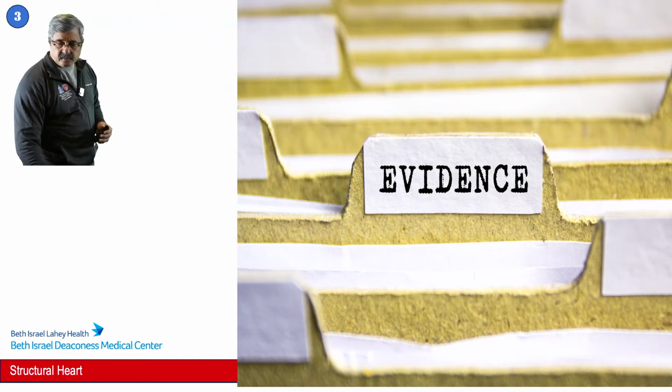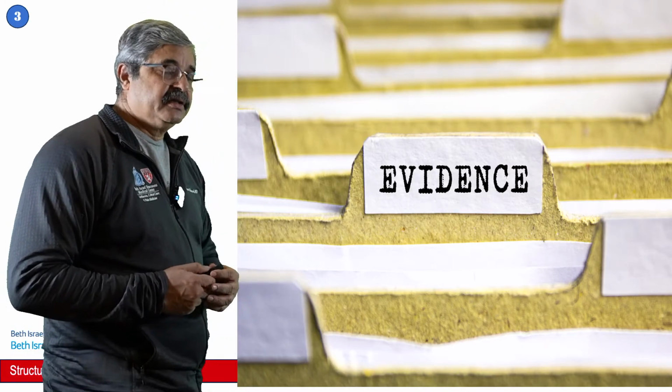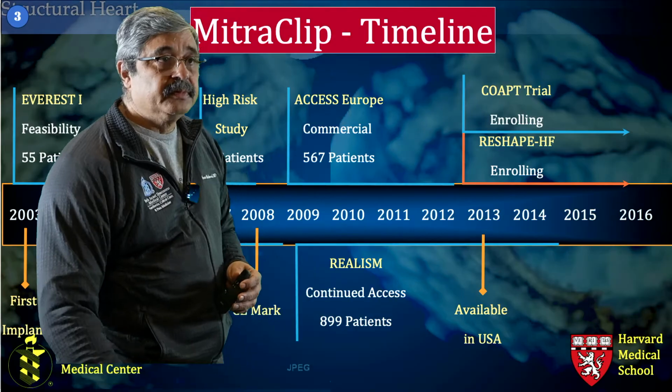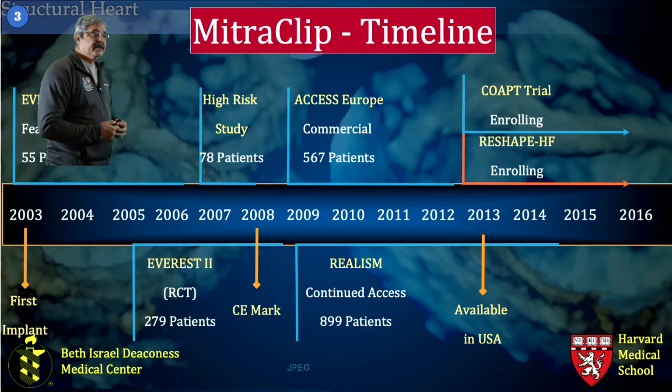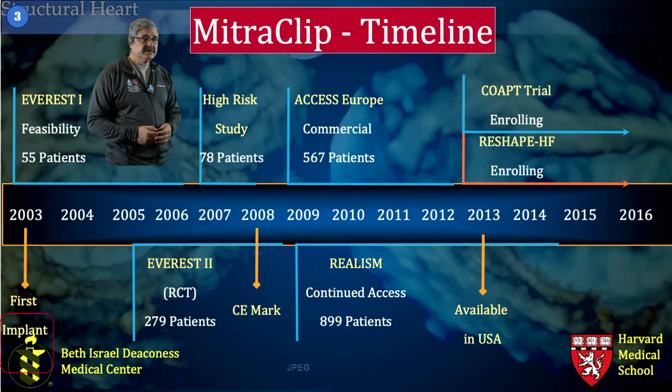Now let's go over what the evidence states for these devices. This is a very important part. So let me get to the major part of it. The first implant, as you can see, was implanted in 2003.